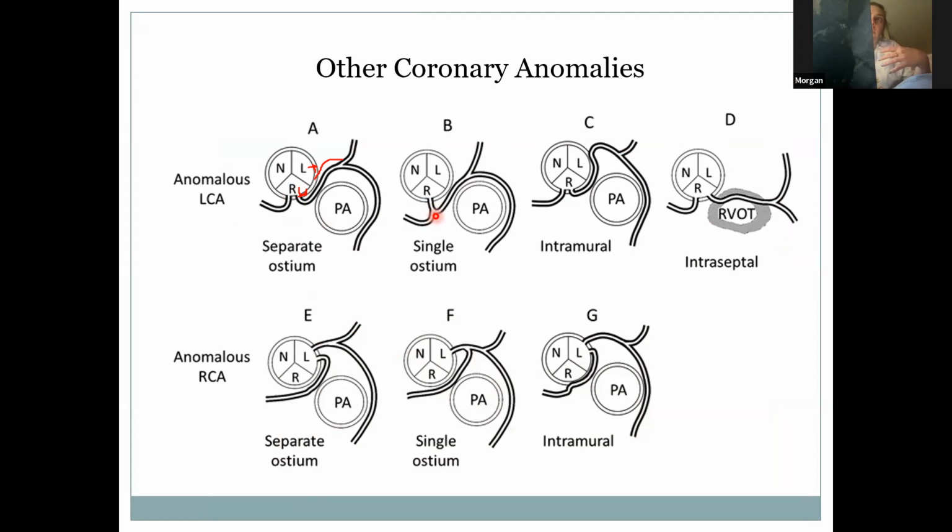In that case, I guess what they decided to do, they had to replace the aortic valve, and they did the TAVR, and they left the anomaly alone, and then they deployed the valve, and they were just hoping that it wouldn't pop the artery. After they deployed the valve in the TAVR, was there any ischemic change to the heart?